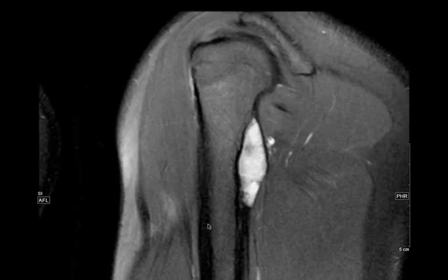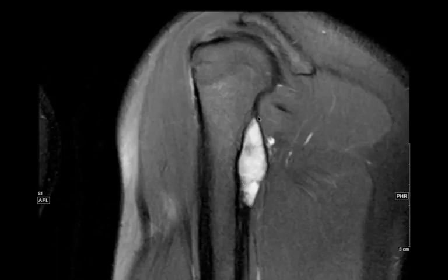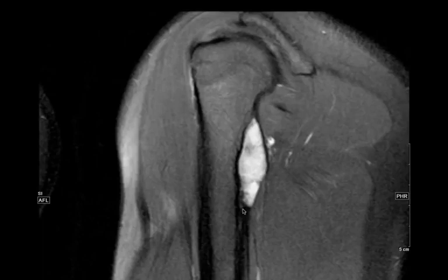This coronal MR shows a nice example of a juxtacortical lesion, very bright on T2-weighted sequences. This one was a juxtacortical chondroma — a really nice example of how it's arising right next to the cortex of the bone, kind of in the periosteum, and then growing under the cortex. You could say it's a cortically-based lesion, and that's fair, but in this case it was a juxtacortical chondroma.